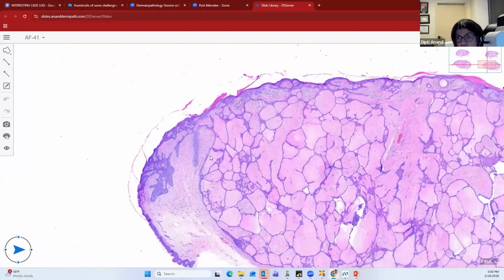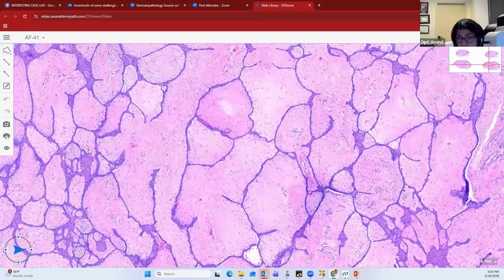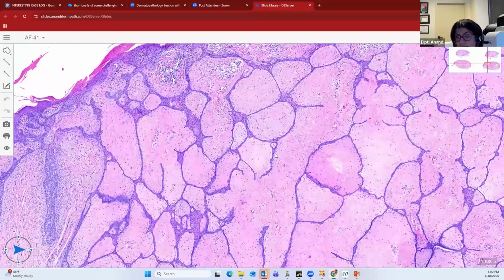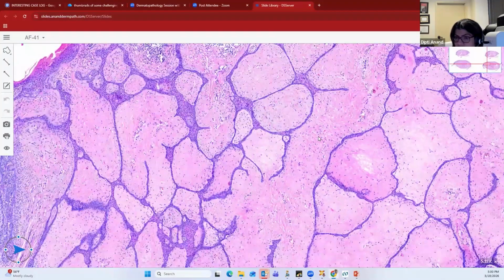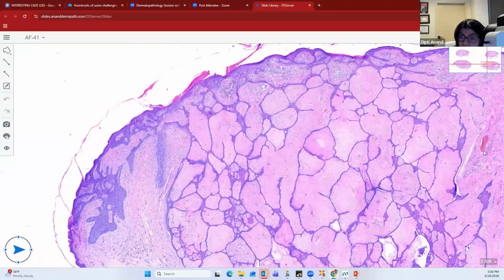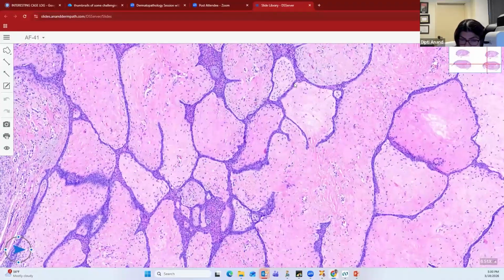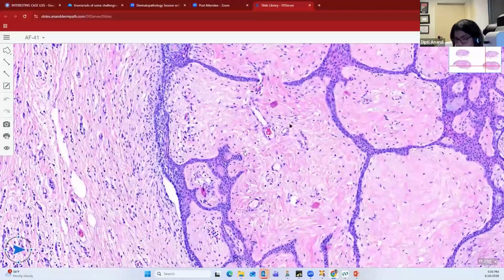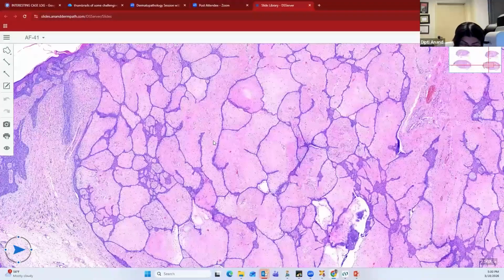And then the morphology of the lesion is classic. You can see these anastomosing thin strands and cords of epithelial islands which have condensed stroma entrapped between them. You can see these nice thin proliferating strands of basal follicular epithelium, and then the corresponding presence of this nice dense pink stroma. In some areas you may see the more conventional basal cells. You often see tumor to stroma retraction, which is a nice feature of a basal cell carcinoma. You can see these cells retracting from the adjacent stroma, so the more classic features can also be present. So this is a Pinkus tumor, or fibroepithelioma of Pinkus.